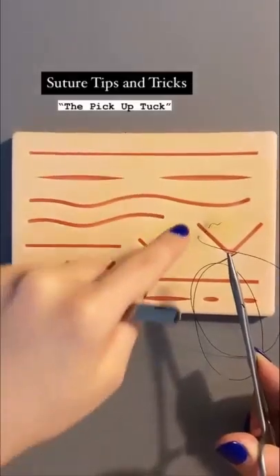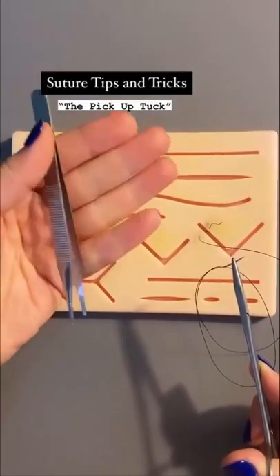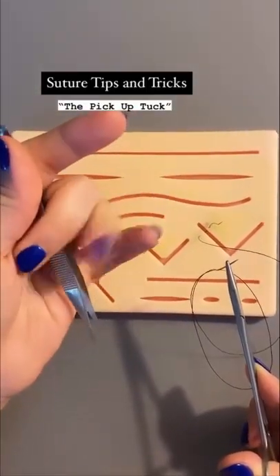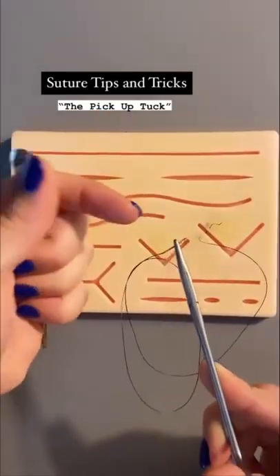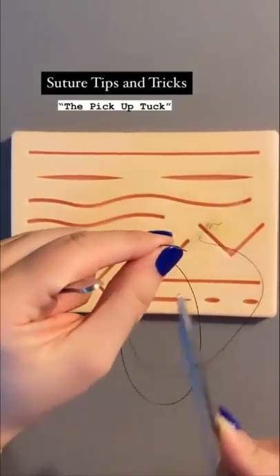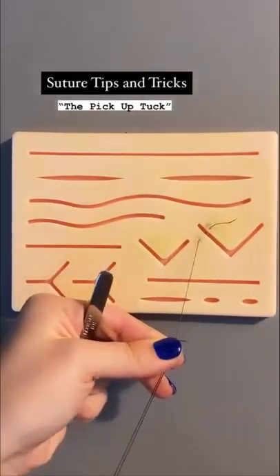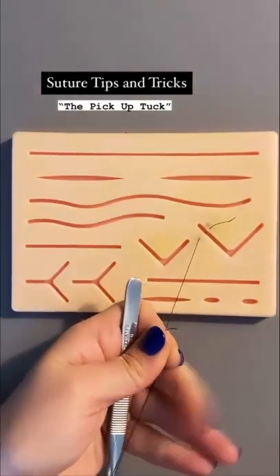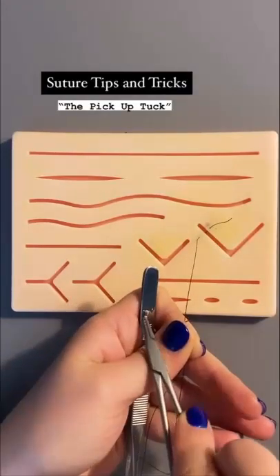How to gather while holding the pickup in your hand: once the needle goes through both sides of the skin, you take the pickup, tuck it in your palm, securing it down with your middle and fourth finger, and keeping it in place with your thumb. When you want to gather, you secure it in place, pick up the needle with your thumb and index finger, pull back — the needle driver pushes the suture down — and you gather in the same manner. Notice how the pickup isn't moving because my thumb is keeping it in place.